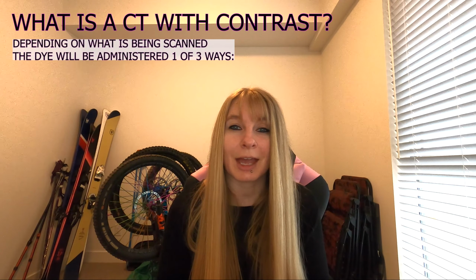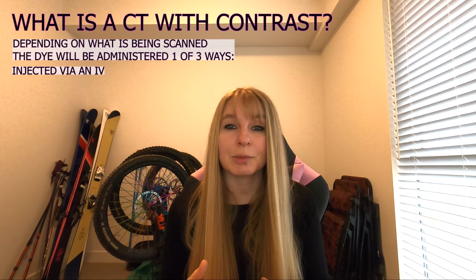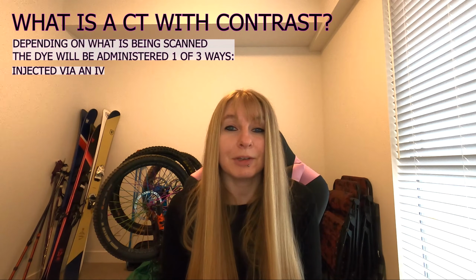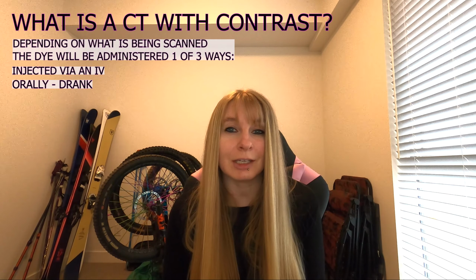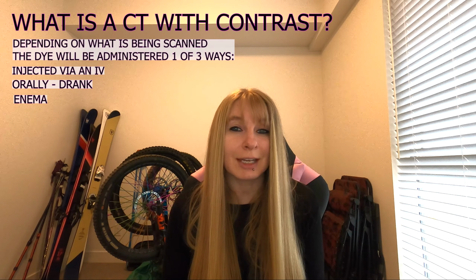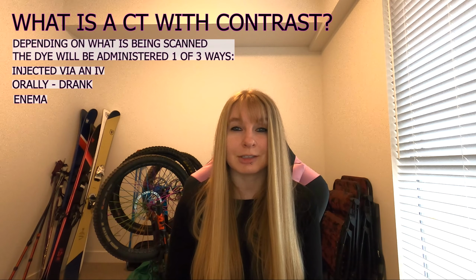Depending on what is being scanned, you'll have the dye administered to you in one of three ways. Through all my experiences, I've always had an IV, so every time it's been injected. But if, for example, you were having your digestive tract looked at, you'd probably be asked to drink a liquid with the contrast material in it, so it would be administered orally. And if, for example, you were having your intestines looked at, then you'd probably receive it via an enema, which is where it's inserted up the rectum.